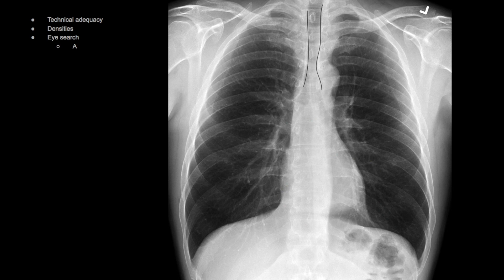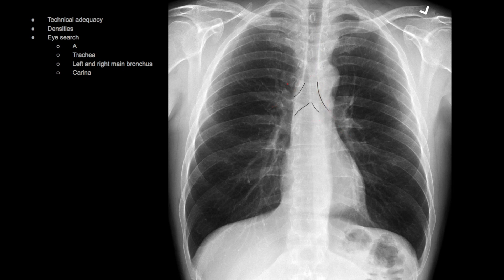We're going to start with A, which is airways. The structure pointed out here is the trachea. The structure pointed out here is the left and right main bronchus and the carina, which is the branch point of the trachea. You want to make sure the trachea is midline, and you want to make sure the carina angulation is not more than 100 degrees.